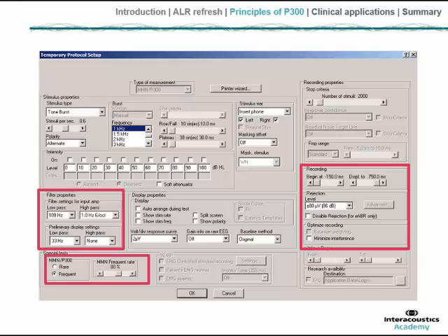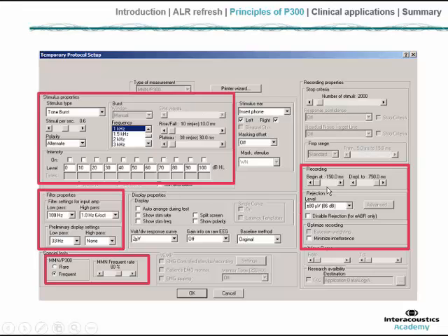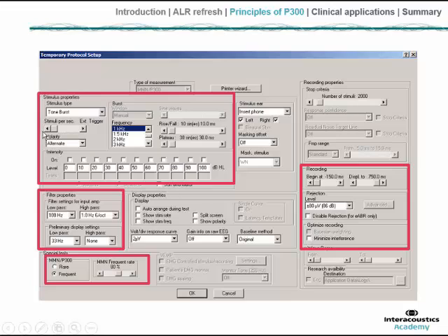A wide recording window maximizes the chance of capturing the response and provides a pre-stimulus baseline, which helps the observer estimate residual noise. At the top left we control the stimuli — tones are most commonly used, but more complex stimuli are possible. It is also possible to set the Eclipse up in a passive recording mode where it doesn't itself present the stimuli; another specialist software presents the stimuli and the Eclipse device is slaved to that software, recording the response at the appropriate moment.